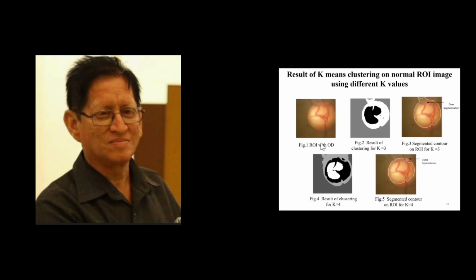This is the input ROI image. First, I assign the cluster center as 3, so 3 clusters will be detected: the first one, the second one white, and the third one black. I trace from these clusters; the corner cluster will be removed. The remaining two clusters are clubbed and the boundary is traced, but the boundary is not obtained properly from this cluster.